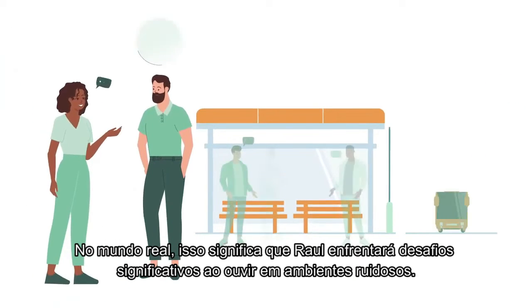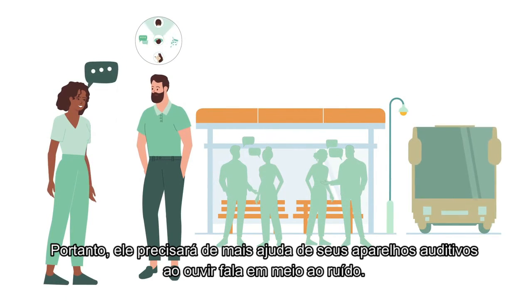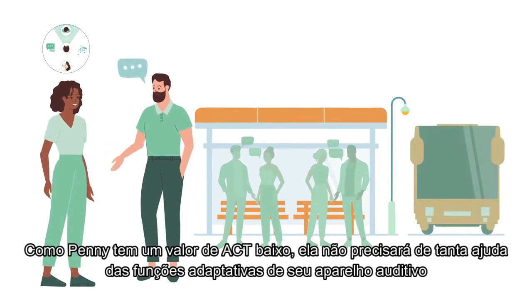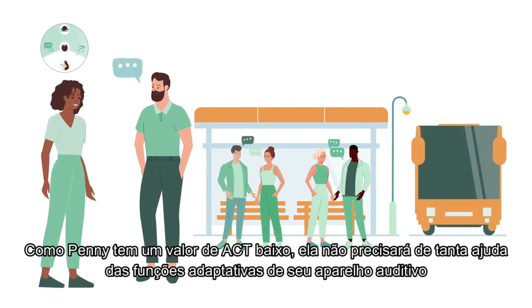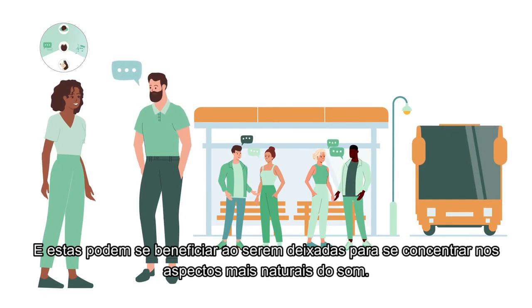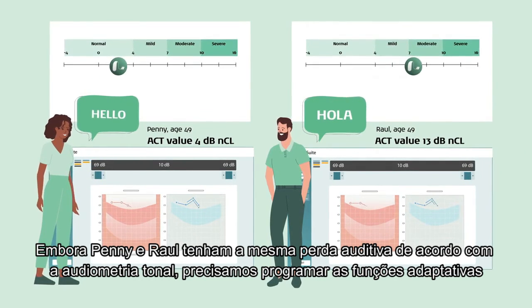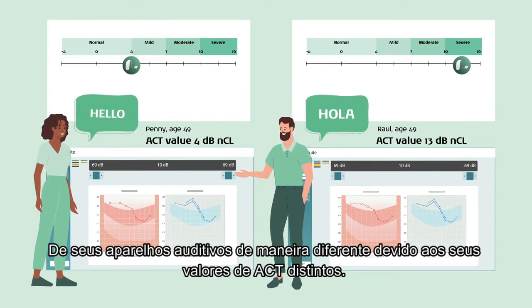In the real world, this means Raul will experience significant hearing in noise challenges. He will therefore need a lot more help from his hearing aids when listening to speech in noise. As Penny has a low ACT value, she will not need so much help from her hearing aid adaptive features, and these can benefit from being left to focus on the more natural aspects of sound. Although Penny and Raul have the same hearing loss by Pure Tone audiometry, we need to program their adaptive hearing aid features differently because they have different ACT values.